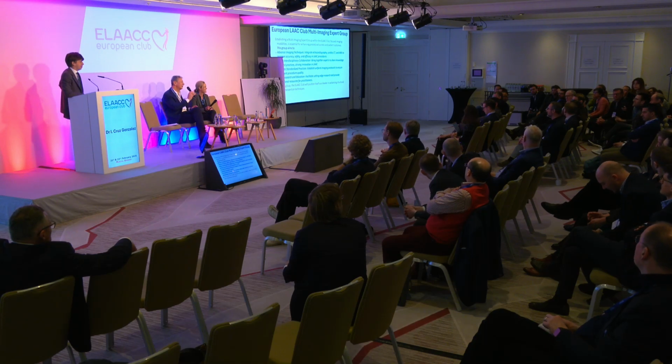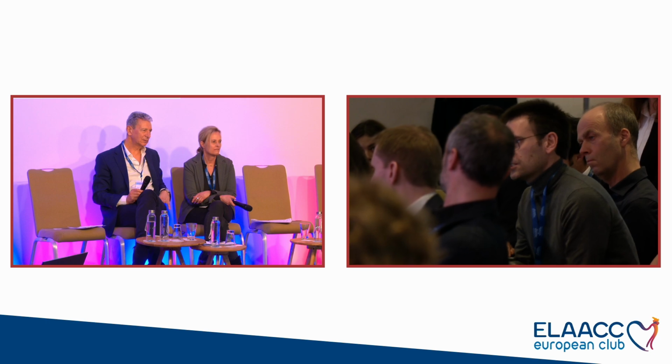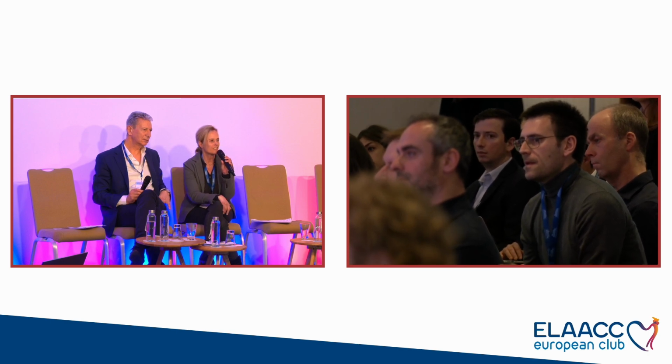Yeah, no, Xavi. I think the question would be, can we compare the 3D possibilities of both mini TE or ICE compared to regular TE or CT? I mean, can we avoid the pre-plan with those 3D tools? Laura actually answered it, and I think yes. If the 3D imaging quality is good enough, you have a 3D data set, you can do everything with it. Do we need validation for that, or are we just happy?